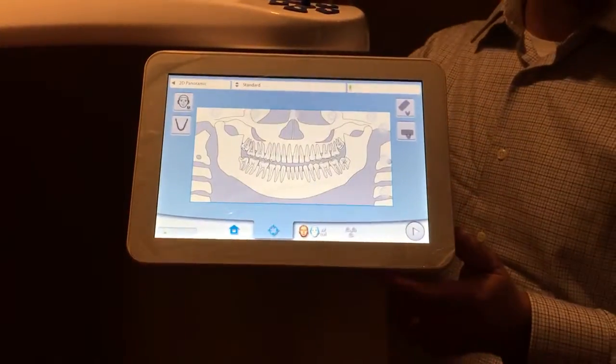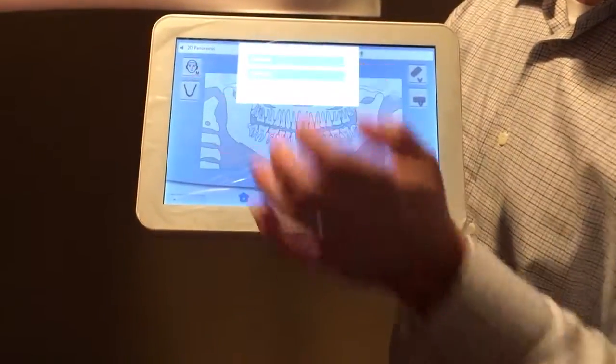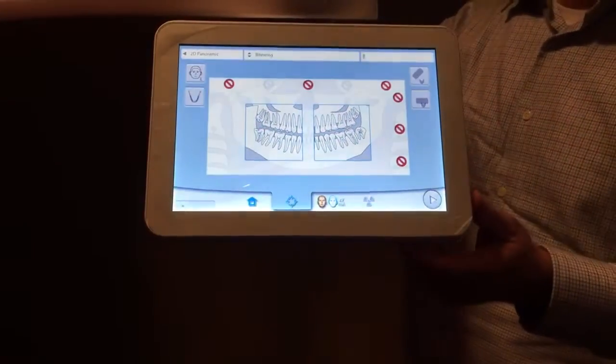Hit pan up top — it'll default to panoramic standard. We want panoramic bite wings. Then select the patient size: if it's a larger adult male, go to L.